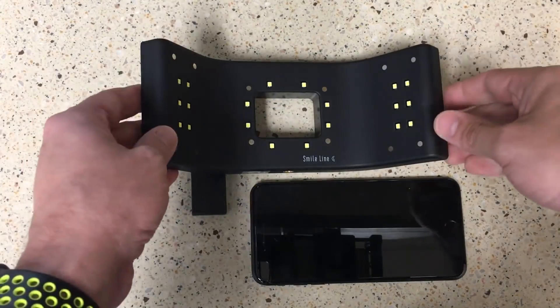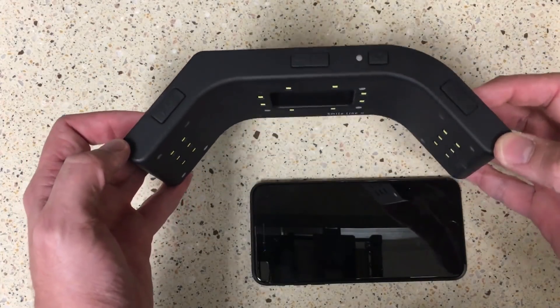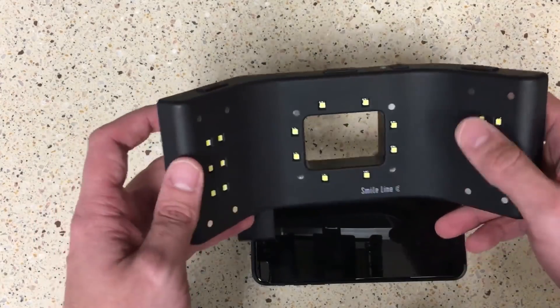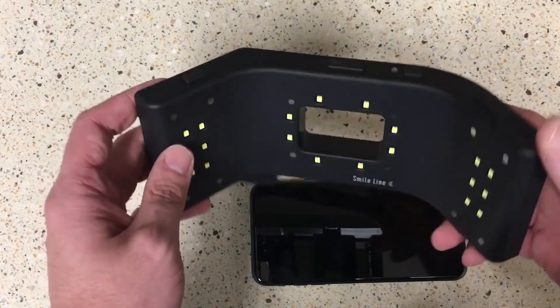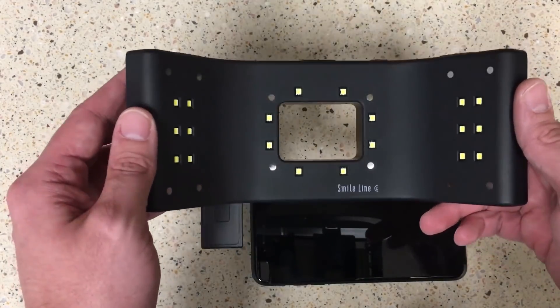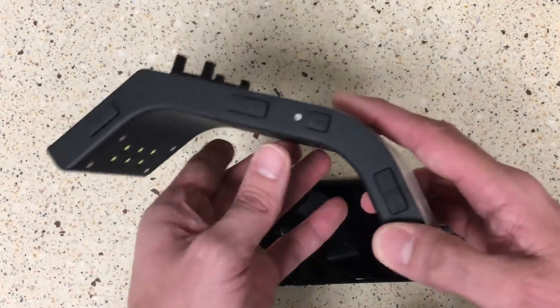Here it is — the SmileLite MDP by SmileLine USA. The MDP stands for mobile dental photography, and what this is going to do is allow you to use your smartphone to take a color-corrected shade-tab photograph next to your patient's tooth for your laboratory. The lights — in the center and on the sides — are all color-corrected, so they eliminate a lot of the washout you get with other types of cameras. Since you're taking this with your mobile phone, you can then easily email or text the photos to your laboratory.